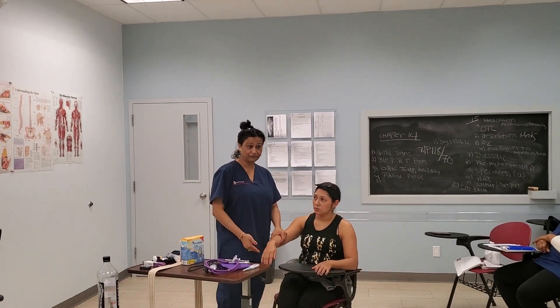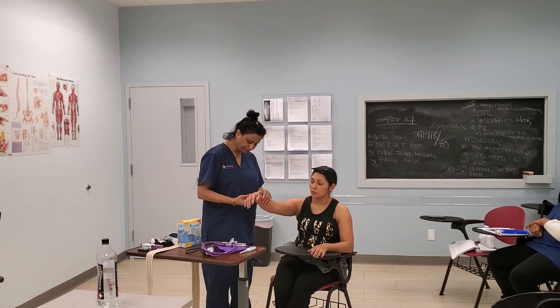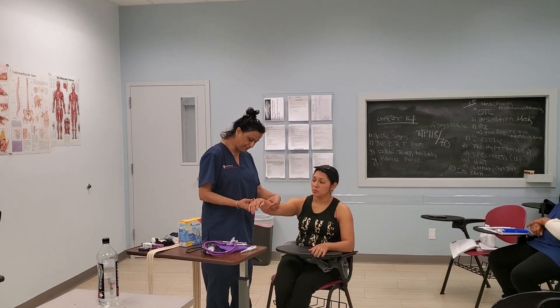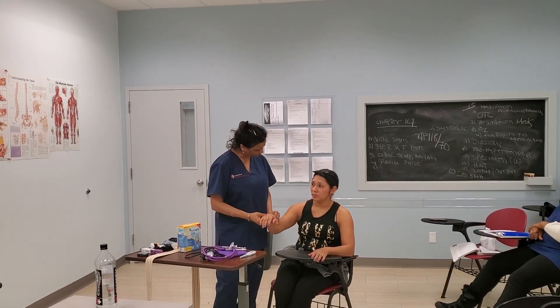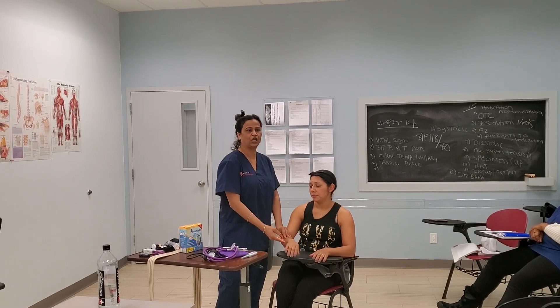After washing my hands, I come back and I am going to do the two identifiers. What's your name? Miss Yolanda. Hi Miss Yolanda, how are you? What is your date of birth? Okay, her date of birth is confirmed. I did my two identifiers — date of birth — and checked the patient's ID.